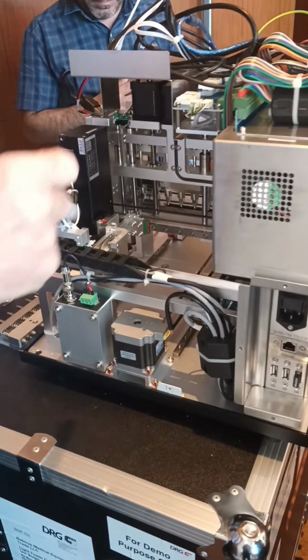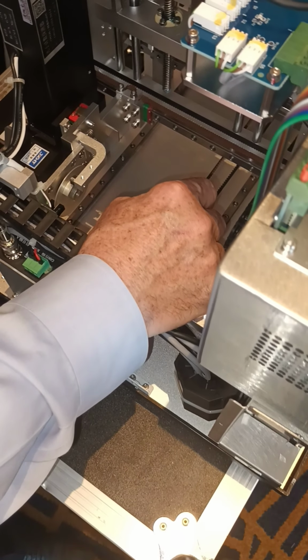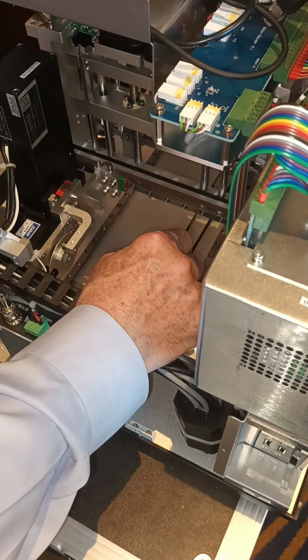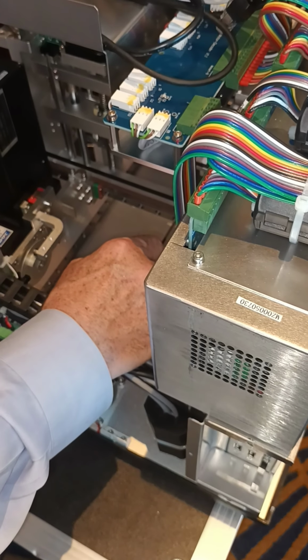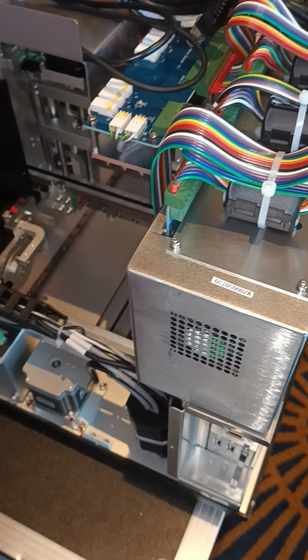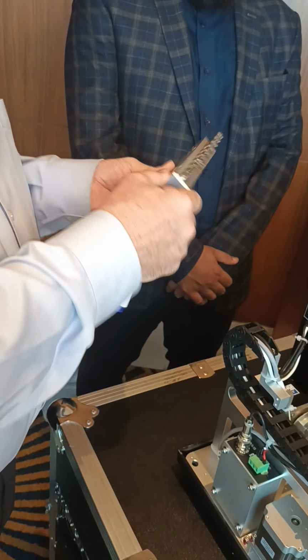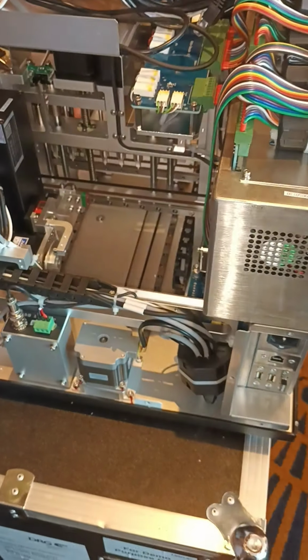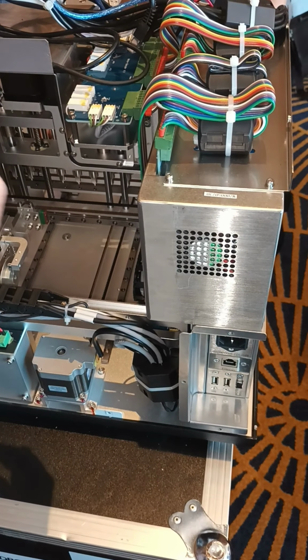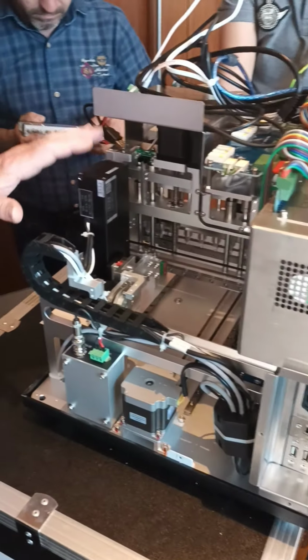Depending on the environment, of course, the lubrication, or the grease in this case, will wear out. Until today, I don't know the exact specification for the lubricant I have to use. We've been supplied by the manufacturer. There's one in the tubes, think the normal one as in the other instrument. Say mechanical. This one is low viscosity grease, and on the syringe is the high viscosity grease. Because this one is getting warmer than this one, and it should stay, it shouldn't leak. If I put the high temperature on the normal one, it will simply become liquid, like a regular lubrication oil, and it will come down. You cannot use the same one in here. It should stay with the temperature specification inside of this device.